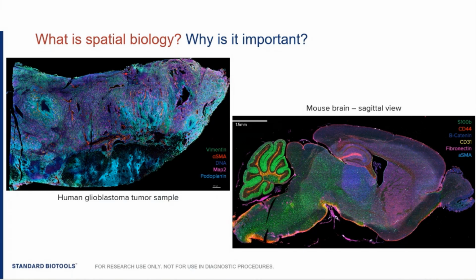Typical immunohistochemistry or immunofluorescence has been the starting point for a lot of spatial biology studies. But as the field rapidly progresses, we need tools that can keep up with the total amount of targets that need to be studied, the ever-increasing throughput of samples to process, and then, of course, image analysis solutions to make sense of all this data.